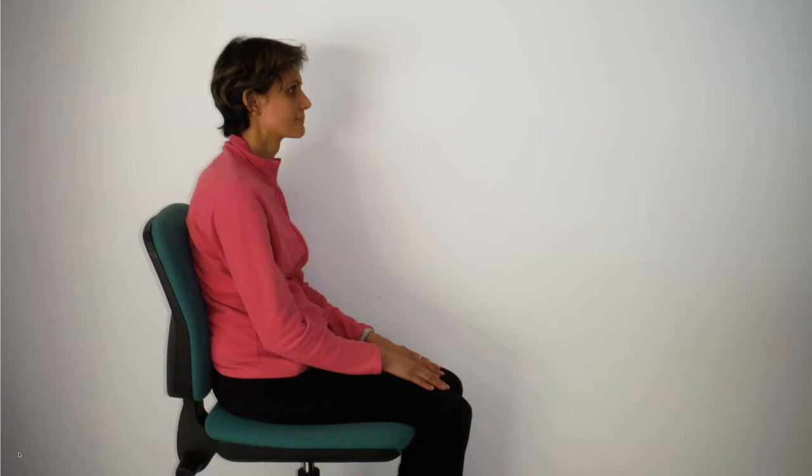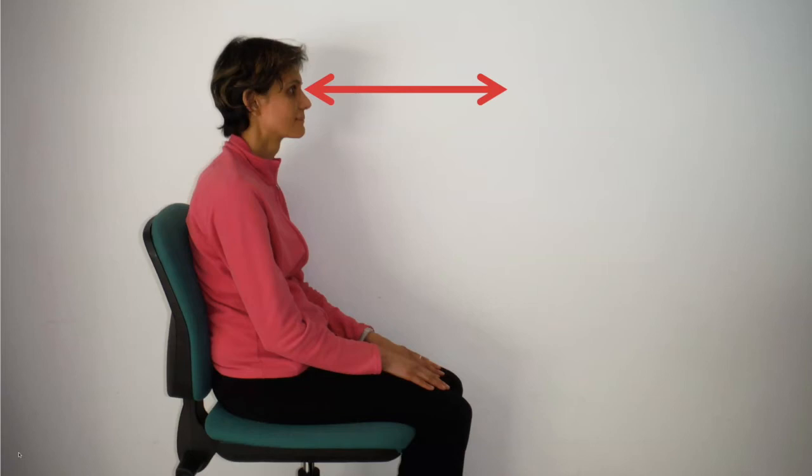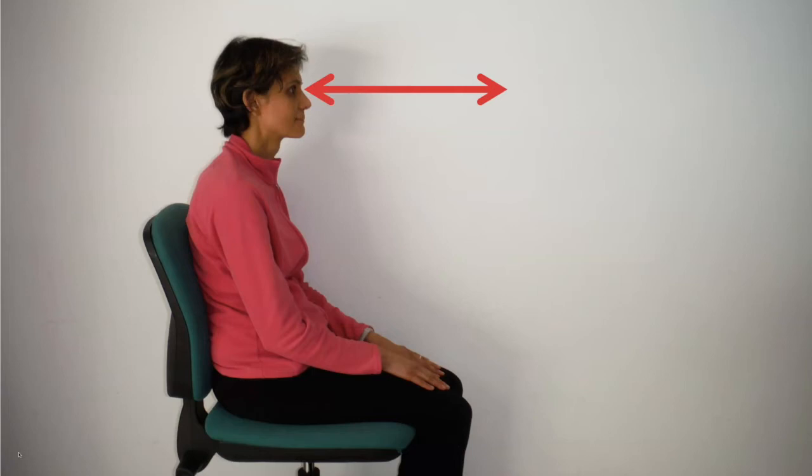You need to sit the patient comfortably with them looking into the distance. You need to situate yourself at the patient's eye level. If you are standing up, it's tempting to come from on top, but if you do so you will not be level with the patient's optic nerve and will find a featureless part of the retina — if indeed you can see the retina at all.